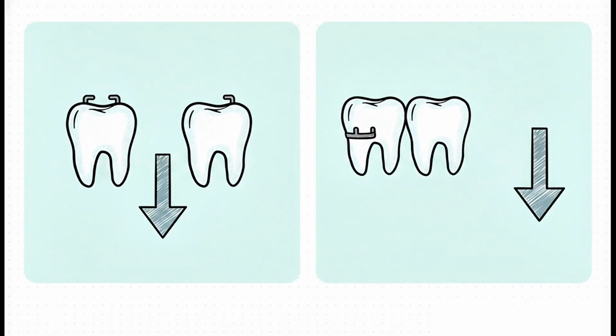And interestingly, the rules for where you place these structural anchors completely shift depending on weight distribution. If the denture is what we call tooth-borne, meaning it's fully supported by teeth on both sides of the gap, you put the rests right next to the empty space. Simple enough. But if it's tissue-borne, where the teeth end and the denture is basically resting on the gums, the physics totally change. You have to place the rest further forward, on the mesial side, the side closest to the front of the mouth, to properly manage the load so you don't end up crushing the underlying tissue.